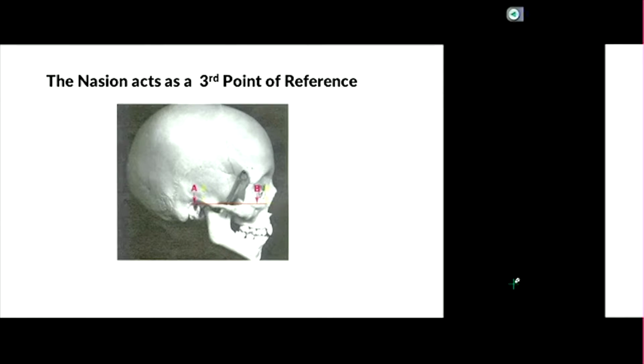So we have this anatomical landmark called the nasion. Think of it as that point just above the bridge of the nose. And you can see in your face bow, you have this little curved area here, and this fits nicely right in that curve. So this instrument, the face bow, has a little feature that can help us position this articulator in relation to the nasion.